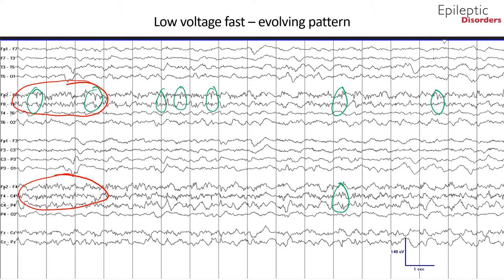There is also spatiotemporal evolution with the right hemispheric chains—specifically the central parietal regions becoming involved with higher-amplitude delta activity that becomes quasi-rhythmic initially and later becomes more rhythmic at 1 Hz towards the end of the epoch, outlined in the green circle and star.